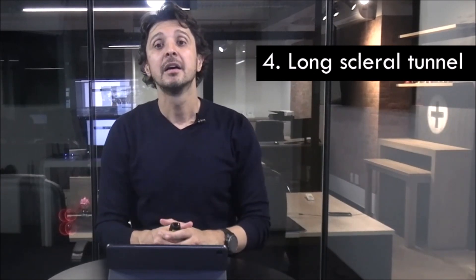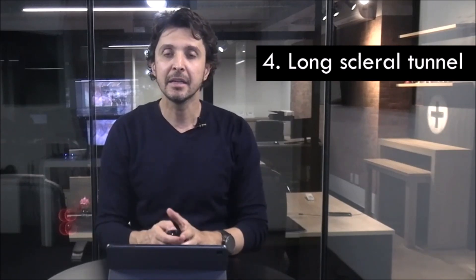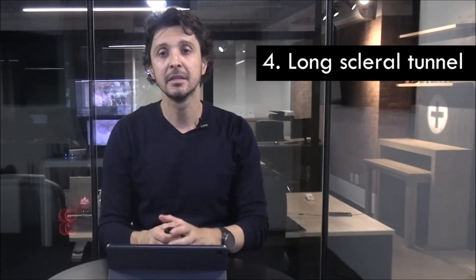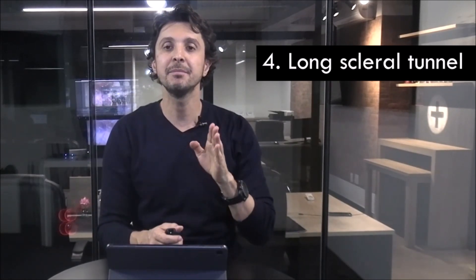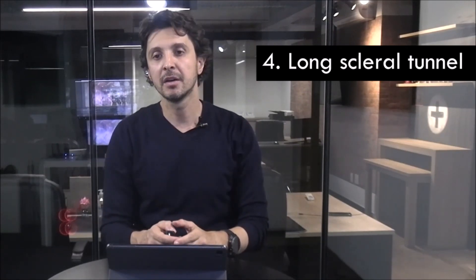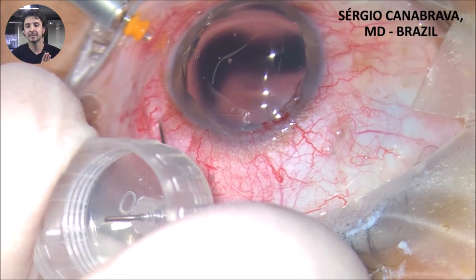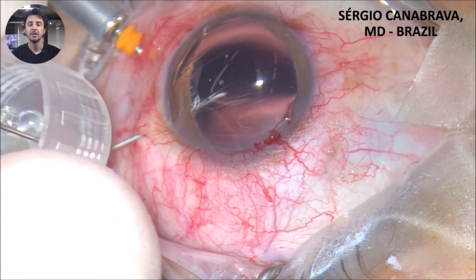Tip 4: a long scleral tunnel. One of the mistakes in this technique when you start is when the surgeon goes directly into the sclera. I did it when I started, but after my research I could observe that it is important to create a long tunnel, as you can see in this video. Observe how I go and create a long tunnel in the sclera and then rotate it to the anterior chamber.